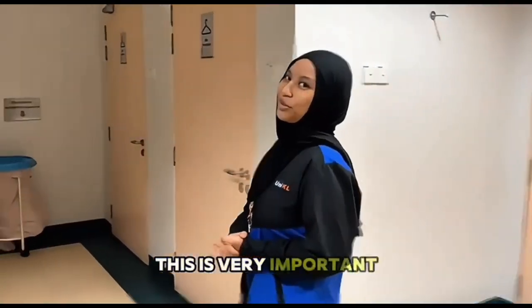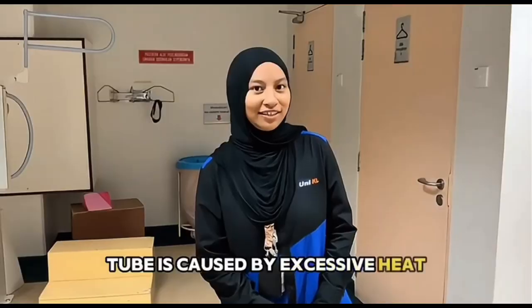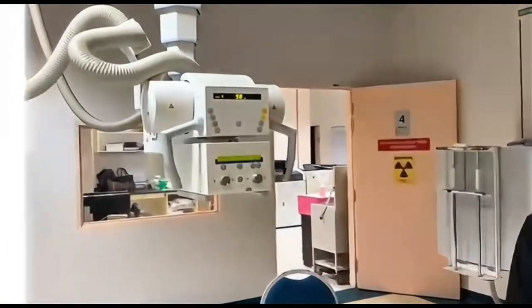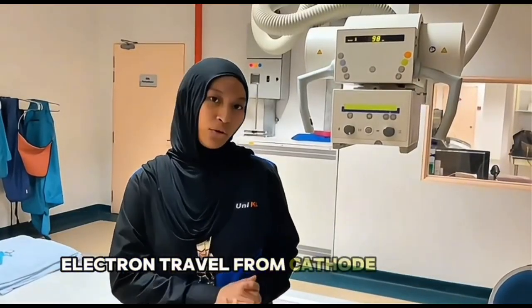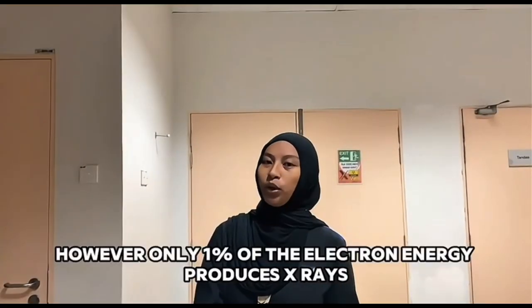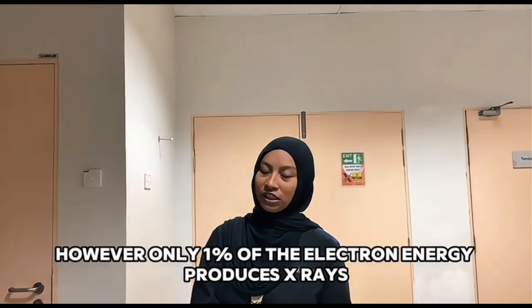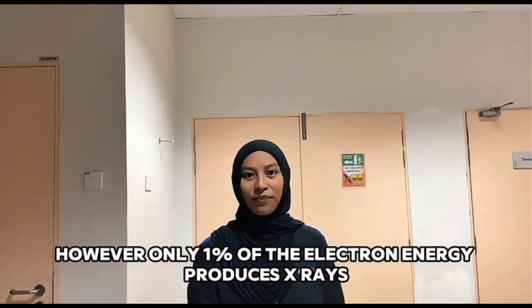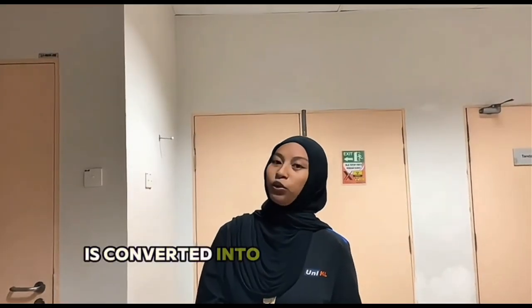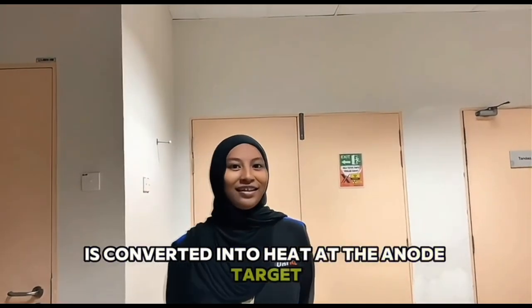In this part, I will be explaining heat production, heat dissipation, and tube rating in the X-ray tube. This is very important because most damage to the X-ray tube is caused by excessive heat. Why is heat produced? When an exposure is made, electrons travel from the cathode to the anode target at very high speed. However, only 1% of the electron energy produces X-rays. The remaining 99% is converted into heat at the anode target.